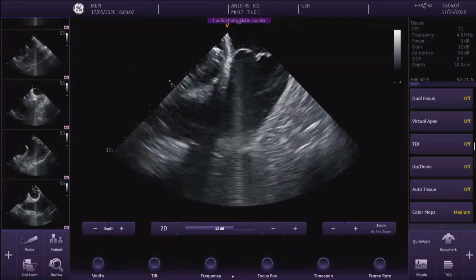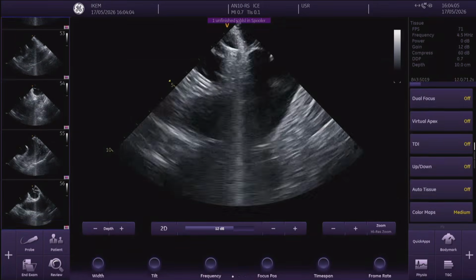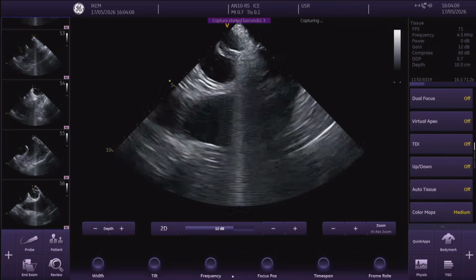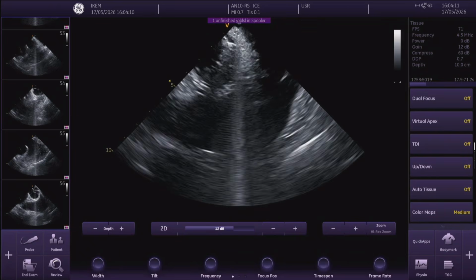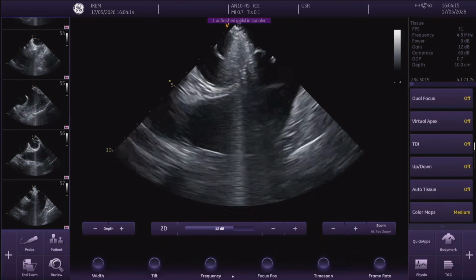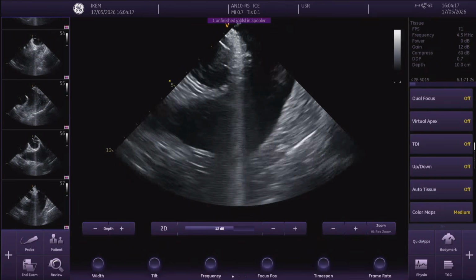Yes. Well, we can add the right ventricle on the opposite side if you wish. So you will see. Beautiful. Yeah, you can give the right ventricle. Yeah. I can go now backwards. Yeah. So you see the right ventricle. Maybe we will have some transparency.